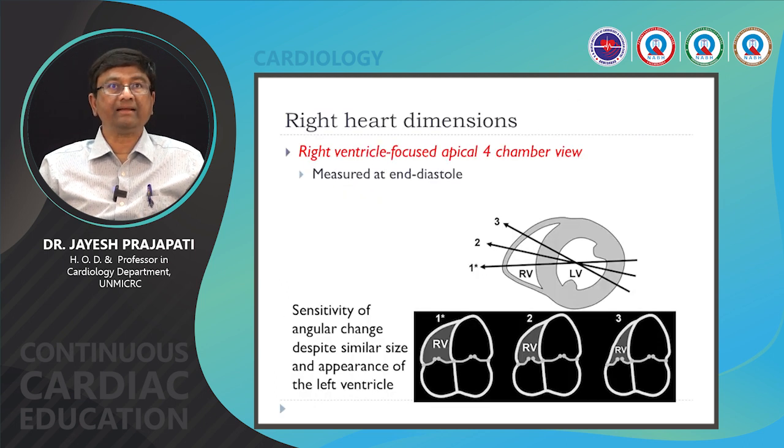And how can we measure the right heart dimension? Right heart dimension is measured in a focused RV 4-chamber view, where with some angulation we can focus on the RV.